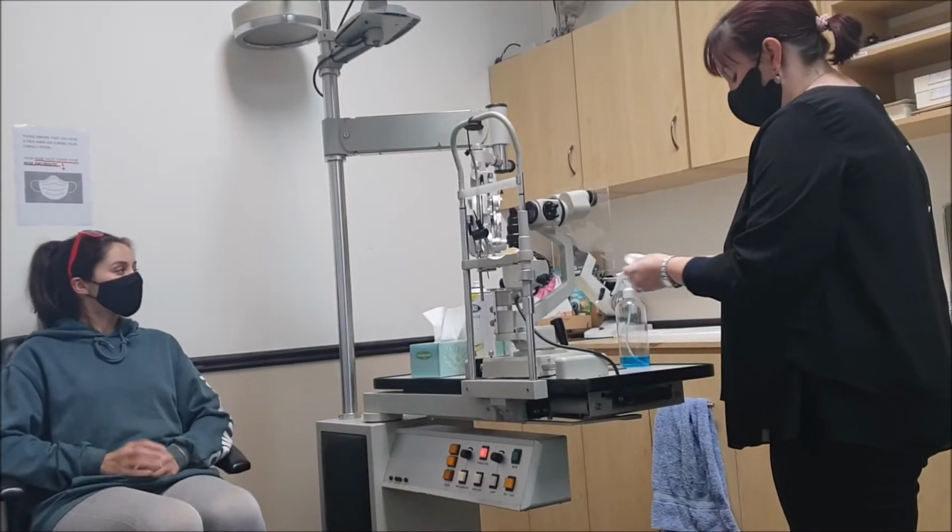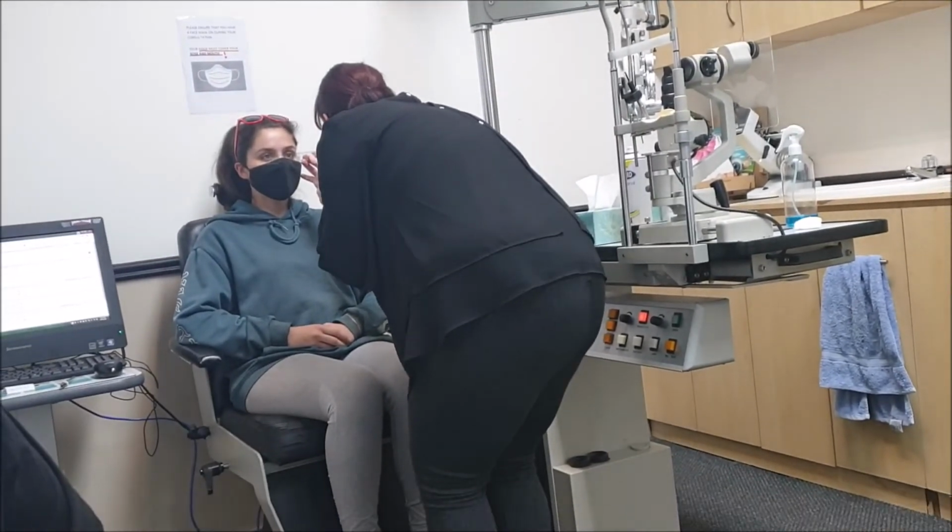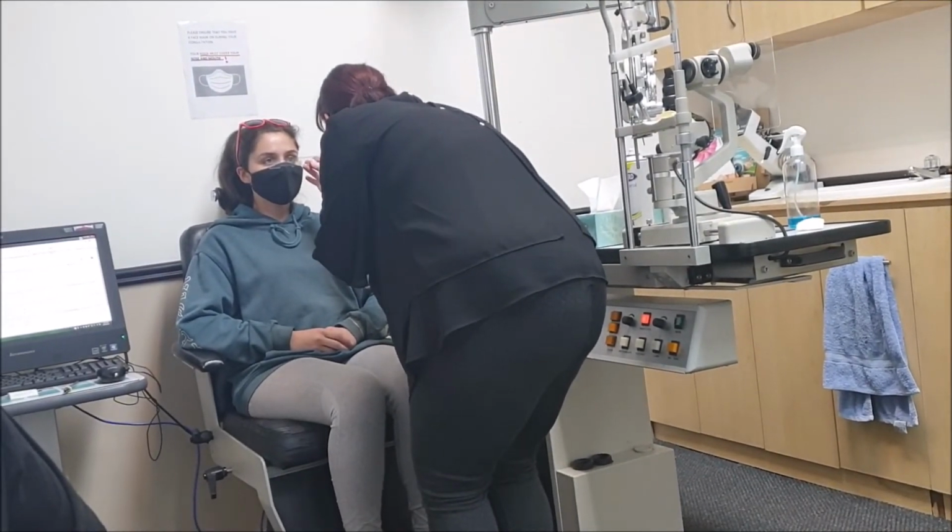The first thing she did is she measured my eyes with a straight-up ruler. It had one little upright piece like this, and then another one that could move on the ruler. What she used this for is to measure my pupillary distance, which is the distance between the middle of one pupil to the middle of my other pupil if my eyes are relaxed and I'm just looking straight ahead. So don't try and focus on the ruler or anything like that. Just look straight ahead of you. She told me to just look over her shoulder so that she can properly measure that distance.